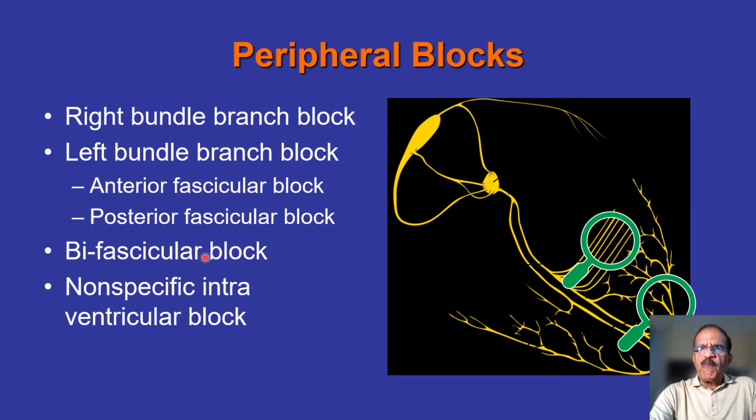We will also briefly discuss bifascicular block, incomplete trifascicular block, complete trifascicular block, and non-specific intraventricular conduction defect, very briefly.